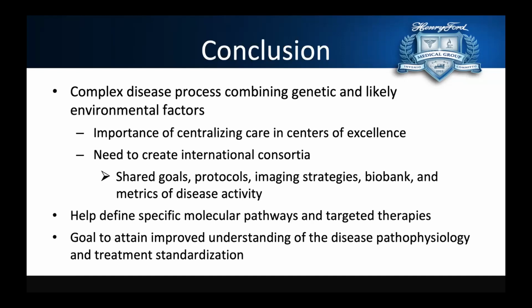One is the exact clinical significance of the presence of an FDG PET finding in the setting of a completely normal MRI is unclear. There is conflicting data as to what to do. So unless there is a very high clinical suspicion of active sarcoid, for example, if you find a young person who has an AV block or VT, typically if anybody has those findings under 60, sarcoid is the leading thought process. And obviously if you do an MR and MR comes back squeaky clean, then we do a PET, then we basically raise the question if PET shows inflammation.